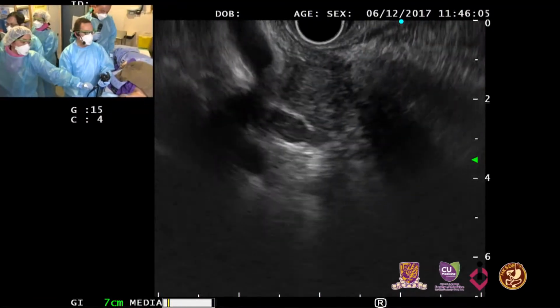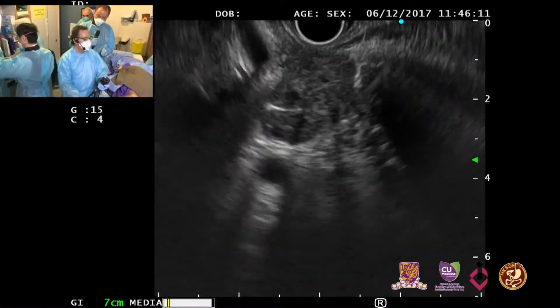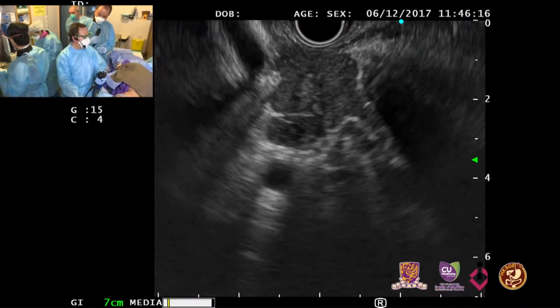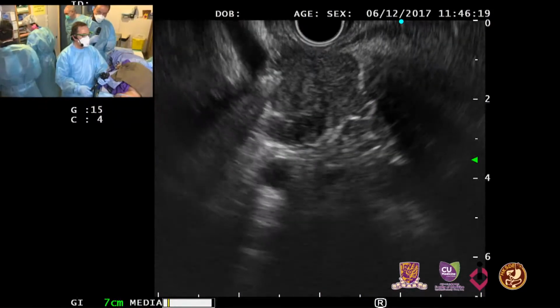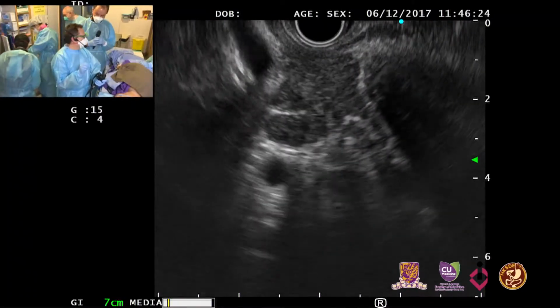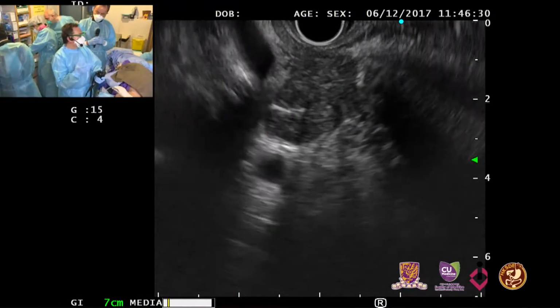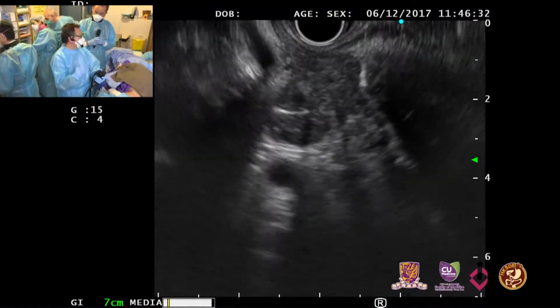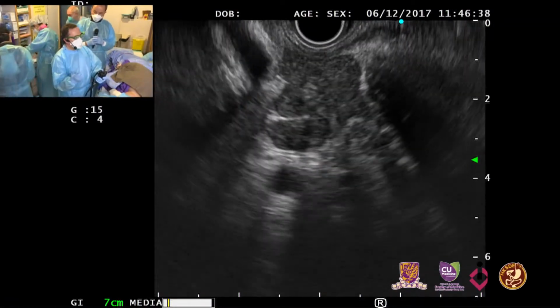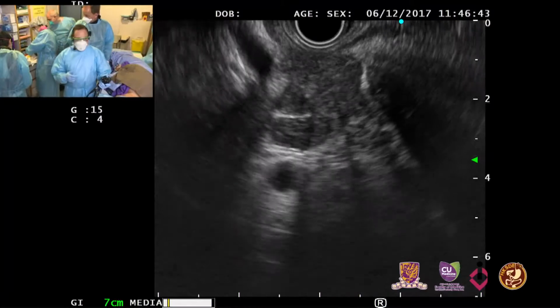Irving, this is a very nice demonstration. I'm not an EUS guy, but from what I know, the meta-analyses don't show any significant difference in accuracy in comparing suction or no suction, for example. In my experience, when you do a lot of suction for FNA of solid masses, you cause more bleeding. So our standard technique is 25 gauge, no suction, capillary technique, and our accuracy is close to 90% with a couple of passes.